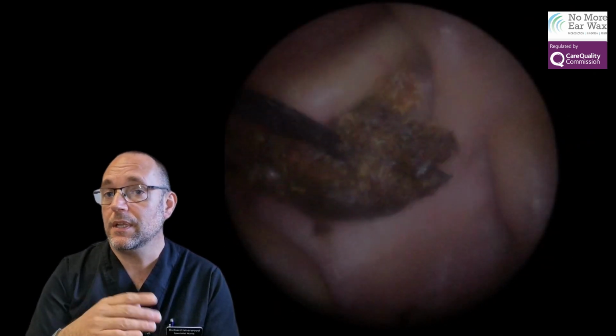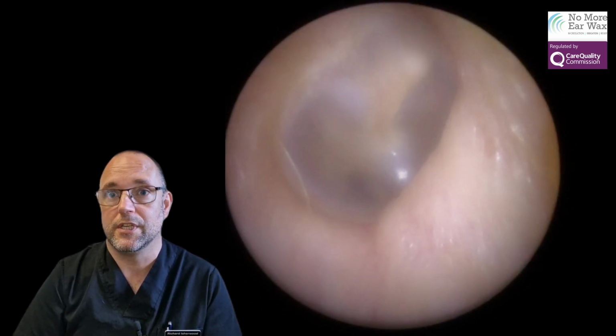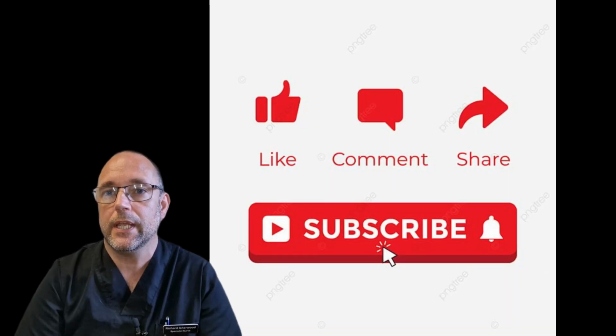It was a beauty. And like I said, didn't think he had a problem in this. But he noticed the difference straight away, obviously. And there's a nice, clean, shiny, clear eardrum afterwards.